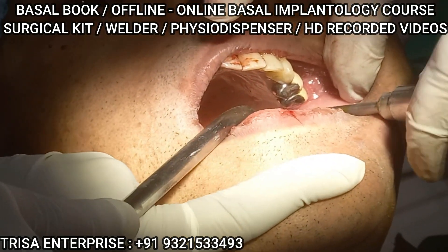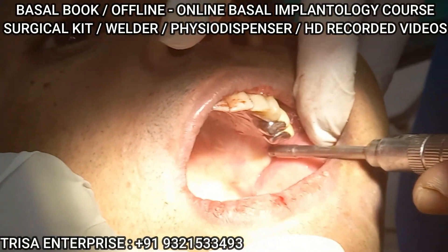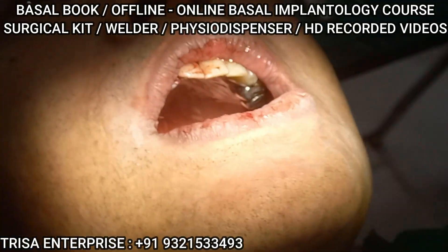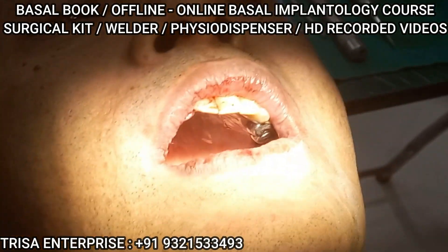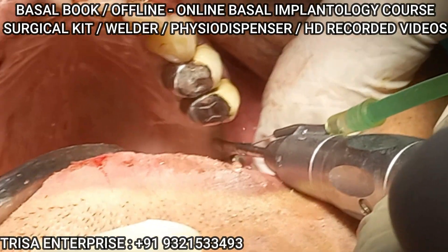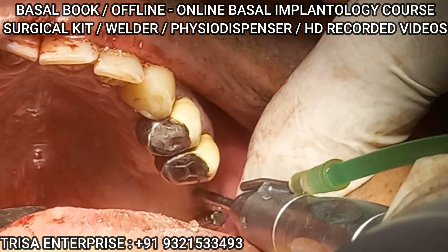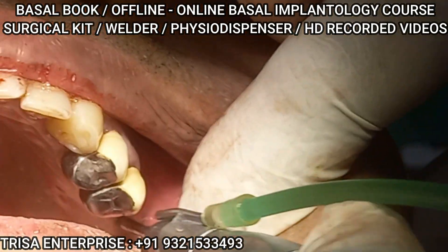Now I have started to get torque again — that means I reached the opposing cortical. Just slowly, okay, slowly. Got it, good torque. Feel the top — solid. So trans-sinus: you lose torque but you wait and continue. Once you gain torque through the hole, if it happens it's very good. You go for it — feel it. Done, that's it.